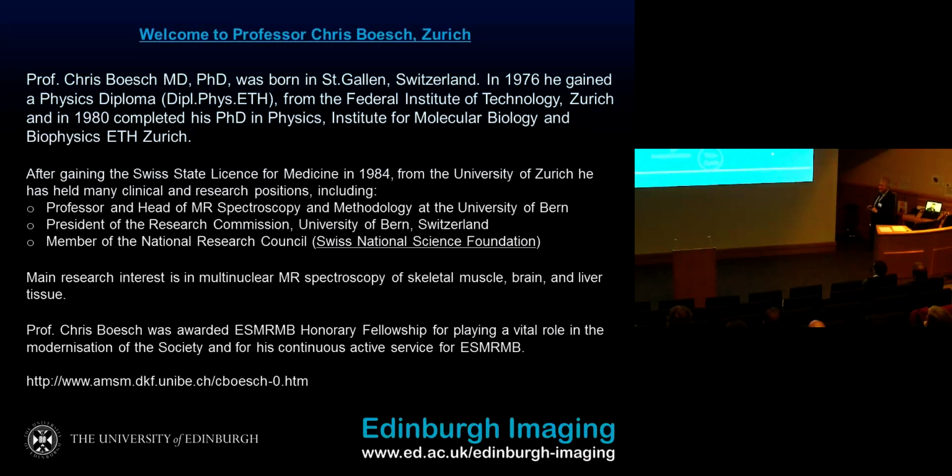When we are looking at lipids, we also have to speak about membranes, which we can study by phosphorus spectroscopy. Here in a multi-center study, they were looking at diffuse large B-cell lymphoma, and they were seeing that they can predict the outcome of the first-line chemotherapy by just looking at the phosphomonoester pool, standardized by the NTP signal. But the phosphomonoester pool is the precursor for the membrane metabolism, and obviously helps us to see how strong the membrane metabolism is activated, and it's then related to this lymphoma and the possibility to influence the growth of the lymphoma.